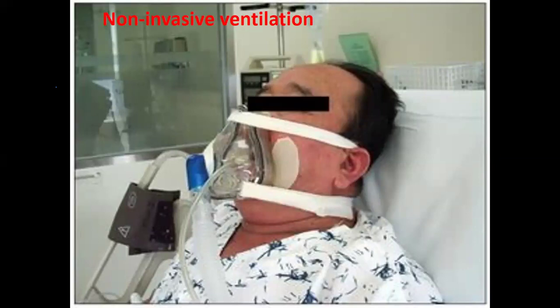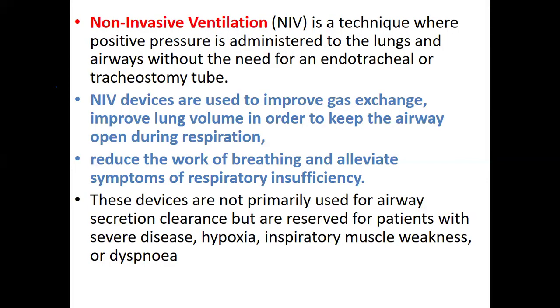There are also devices that work with non-invasive ventilatory techniques. Among them are the following. In this technique, positive pressure is administered to the lungs and airways without the need for an endotracheal or tracheostomy tube.